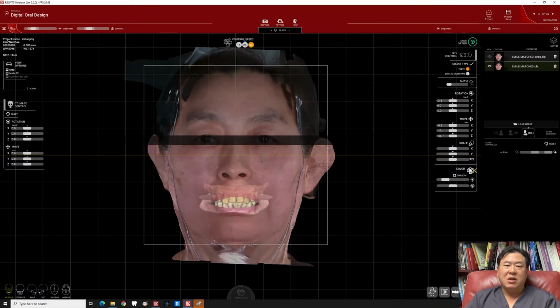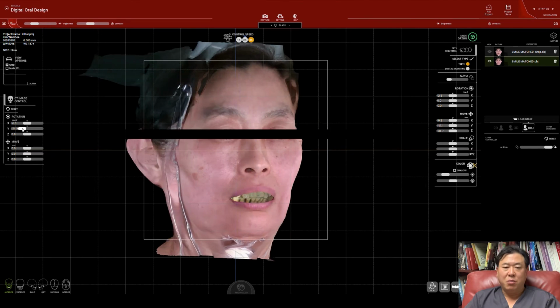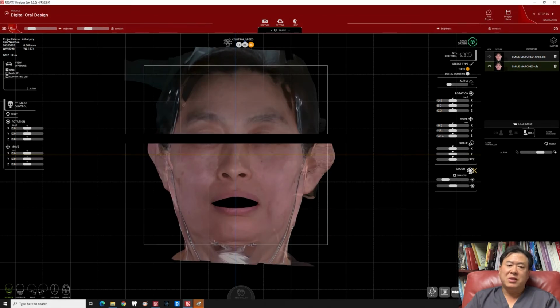3D facial scan was placed into CBCT, and now the patient's whole head is digitalized inside and out. Now we have her facial information, her bone information, and her teeth information. From her 3D facial scan, her teeth portion was removed.